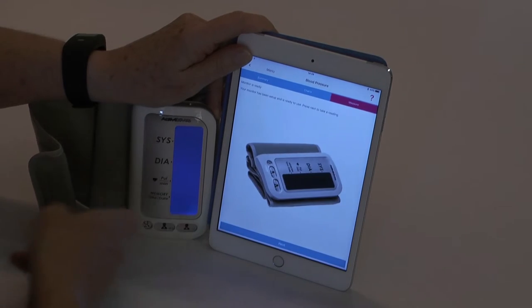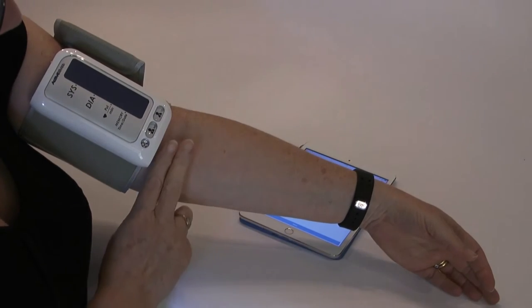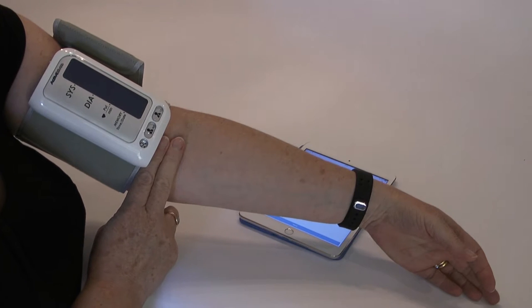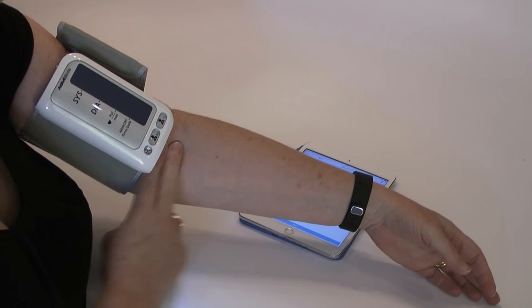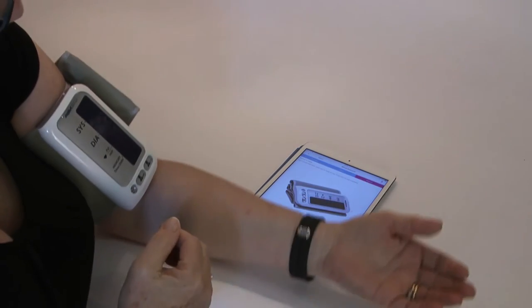Placement of the blood pressure machine should be two fingers above the fold in your elbow, nice and tight, and rest your arm out in front of you.